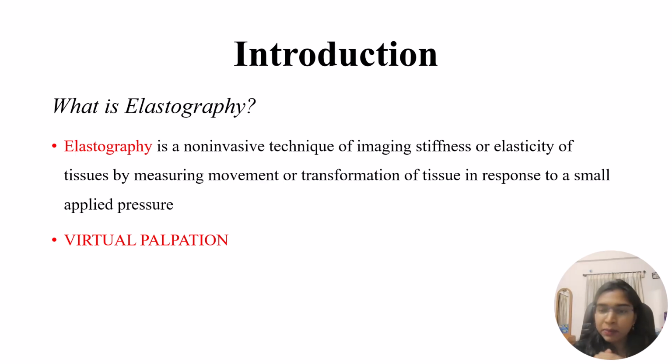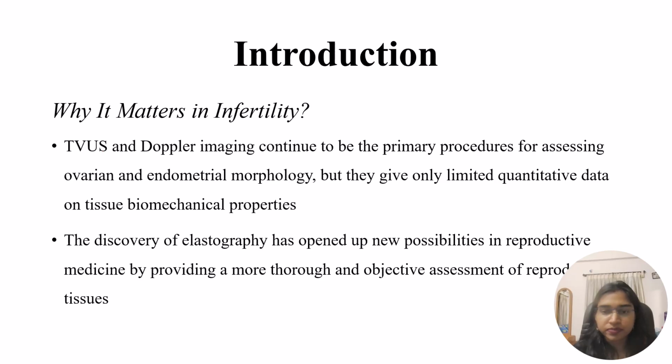जो हम एक्चुअली पाल्पेट करके बता सकते हैं ना कि ये सॉफ्ट है, ये हार्ड अपियर हो रहा है, वो हम अल्ट्रासाउंड से नहीं बता सकते. तो here comes the role of elastography. Elastography is like a virtual palpation. The basis of elastography is only that it is analogous to manual palpation.